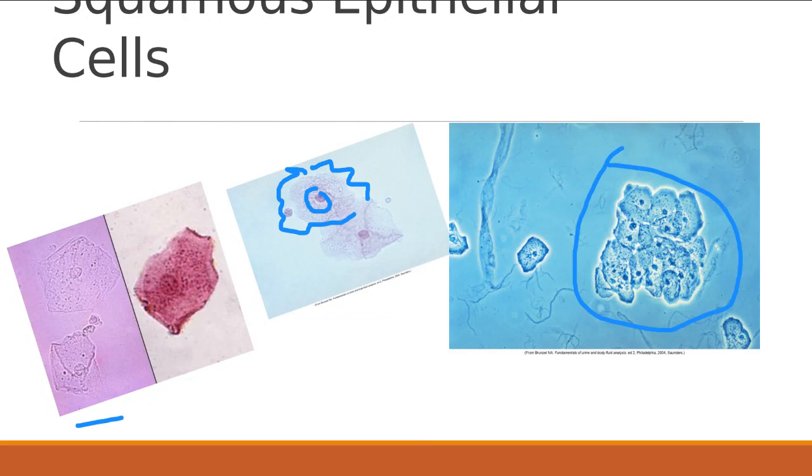If you have a large number of them, it typically will indicate some type of contamination. Now, when we talked about different types of collection methods, which ones were preferable for different types of tests, remember that the midstream clean catch is the one that you want for your microbiology specimens for trying to do a culture.